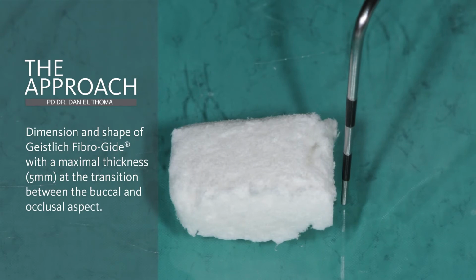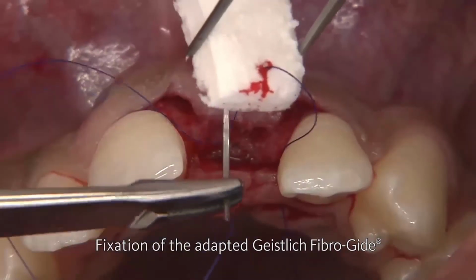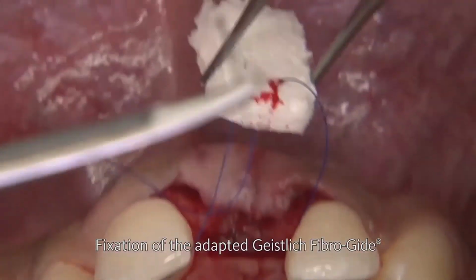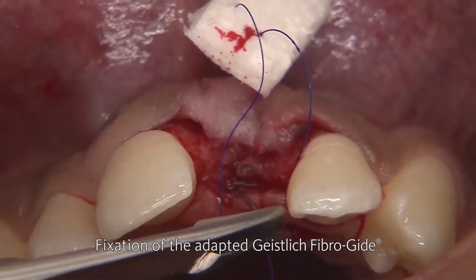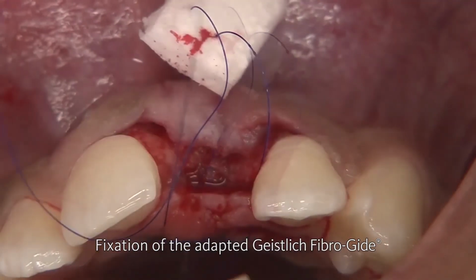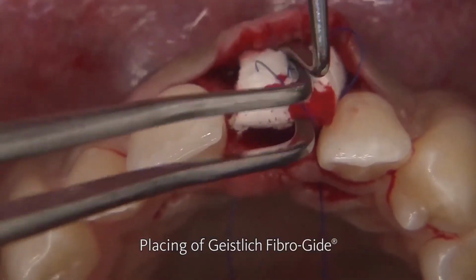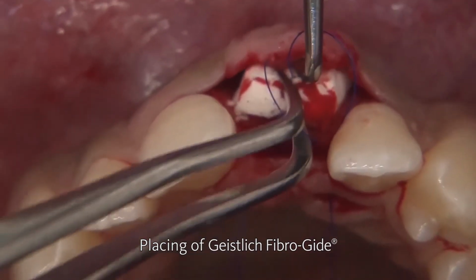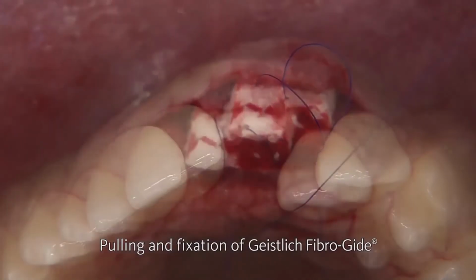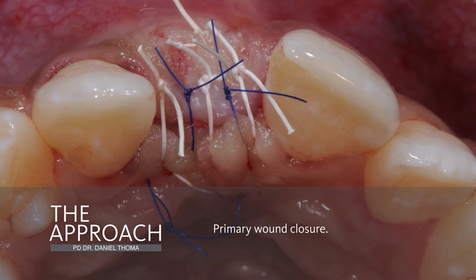Subsequently, the fibro-gide is shaped to match the desired defect site, and thereafter the fibro-gide is being sutured using a horizontal mattress suture towards the palatal aspect. The entire matrix is subsequently placed on the buccal side, inserting it into the pouch. Following the placement and the initial suturing with a horizontal mattress suture towards the palatal aspect, primary wound closure is obtained.